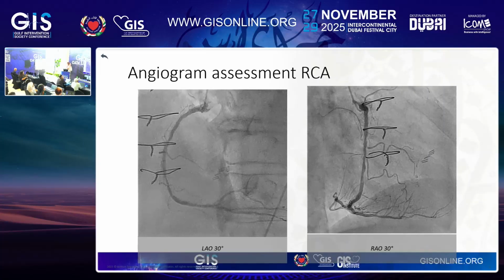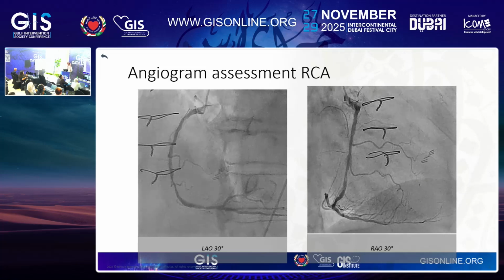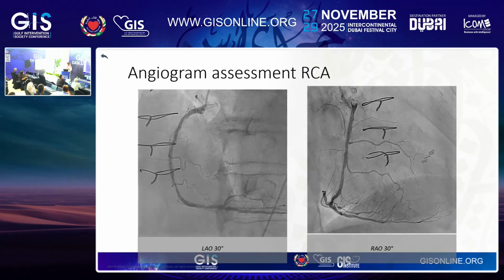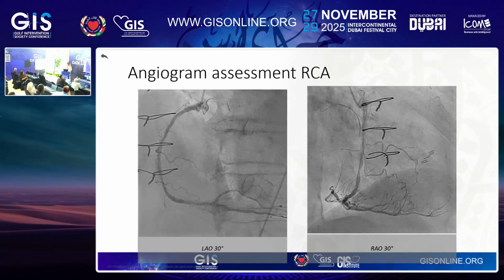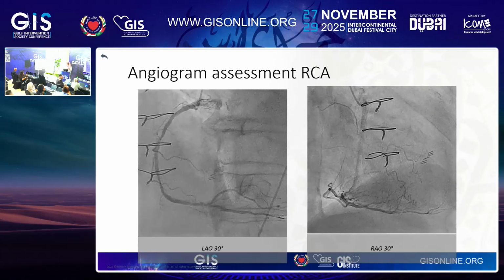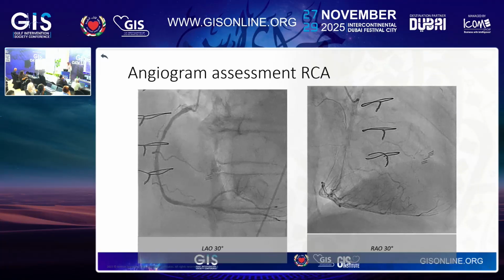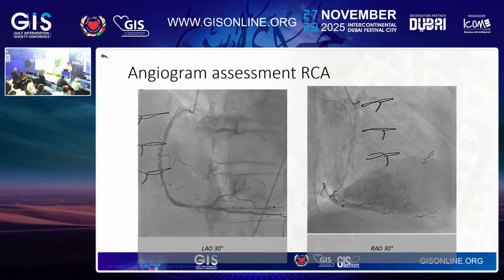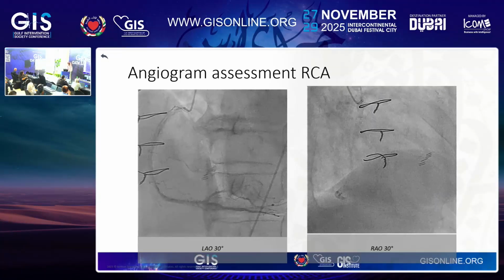And for those of us, I trained and practiced in an era where IVUS was very little in use. I could tell you this had been done before without IVUS. If any of you in your cath lab does not have IVUS, this can be done without, but what did we learn over the last 5 years in terms of information to say IVUS or any type of imaging is better or not than plain angiography?